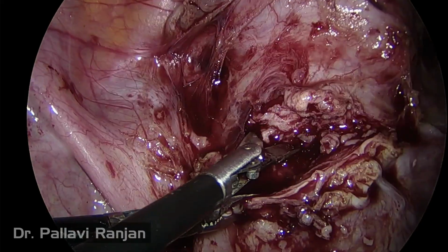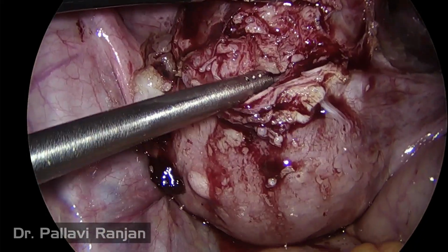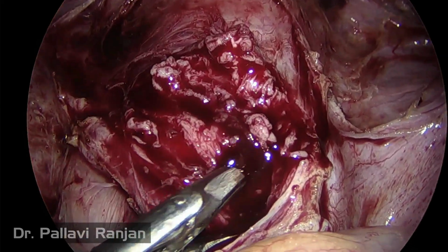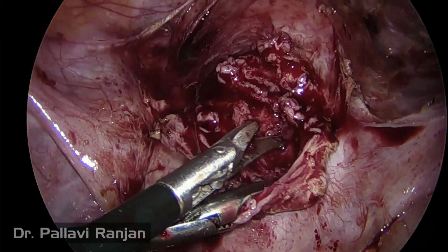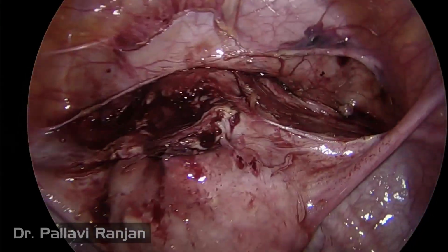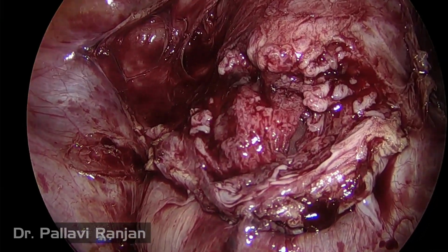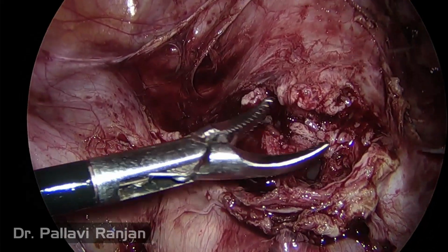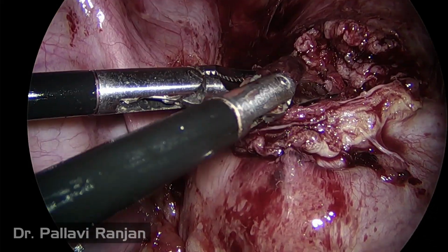So here you can see we are doing the suctioning, and after this suctioning we will do a vaginal curetting and suctioning as well under vision. What my assistant will be doing now is pulling the uterus downwards and inserting a suction cannula, and as you can see the suction cannula here, suctioning has been done. In every ectopic, we remove the excess endometrial tissue which is there due to the Arias-Stella reaction, so that it prevents further bleeding, implantation and infection.